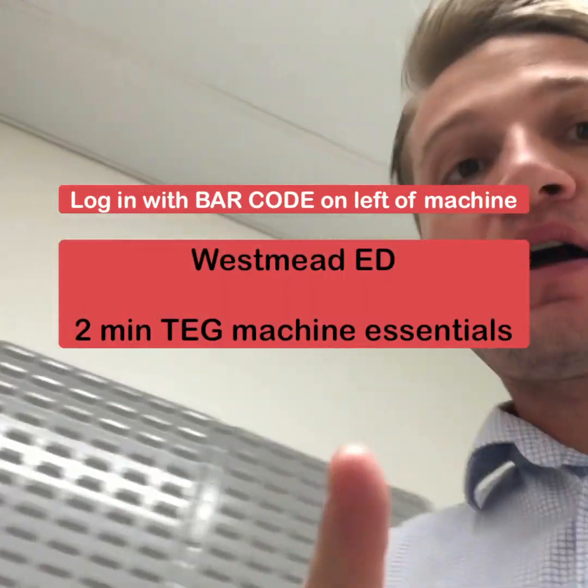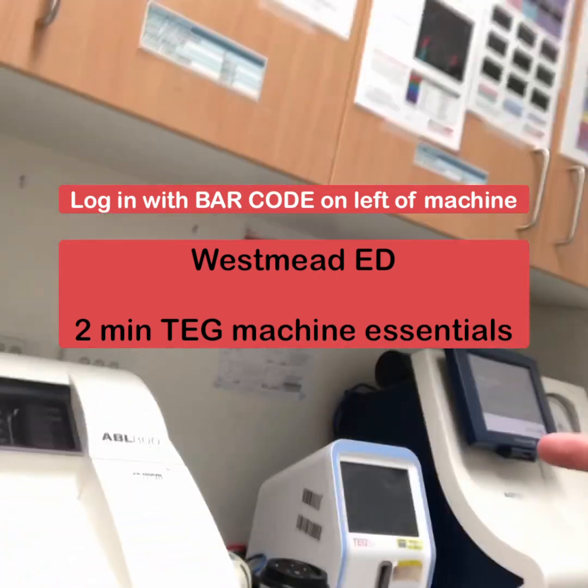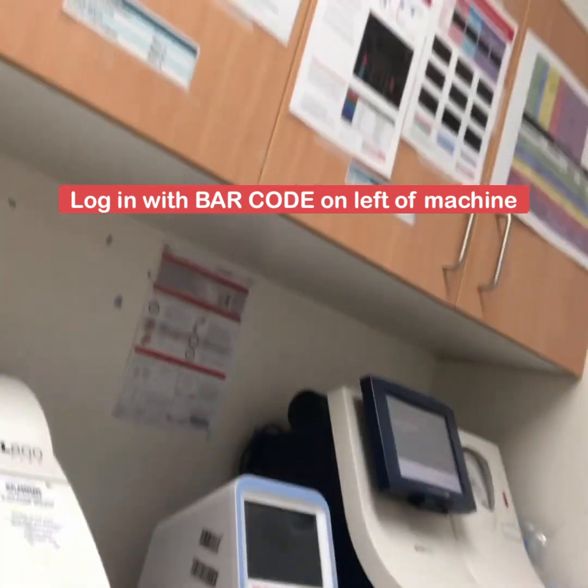We're going to make a two-minute video about how to work this TEG machine in the resource room in Westmead Emergency.